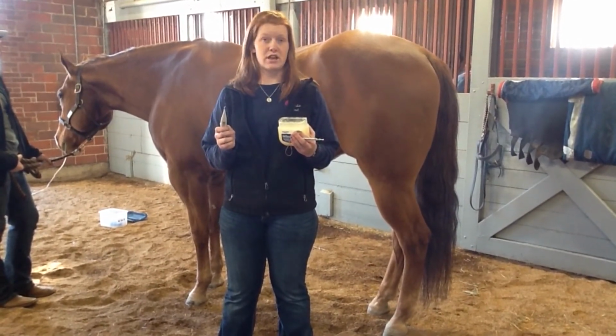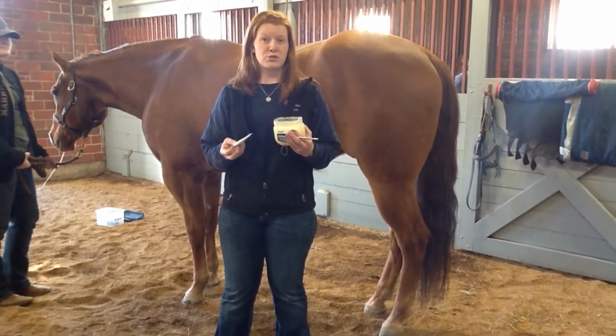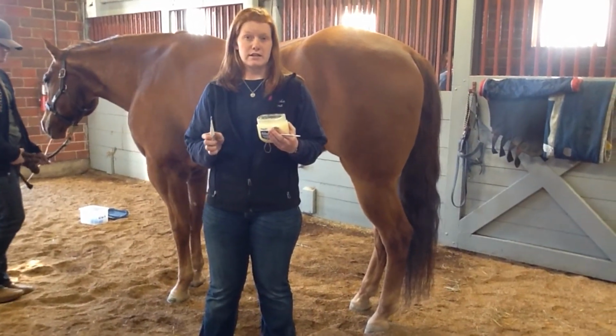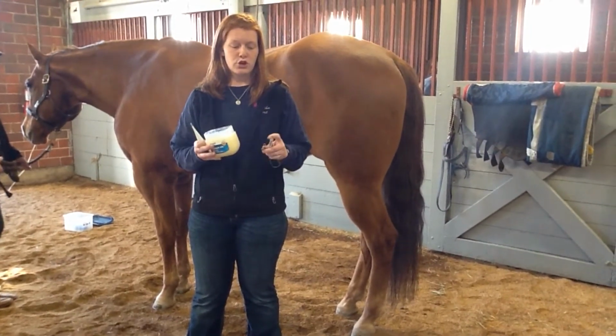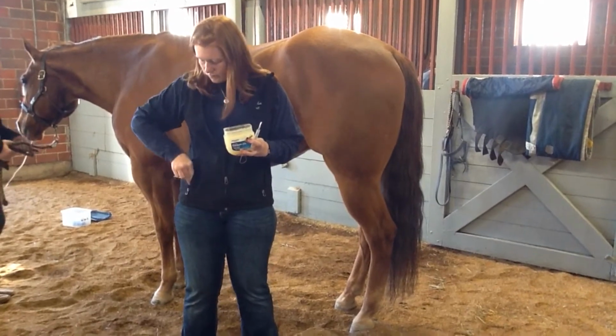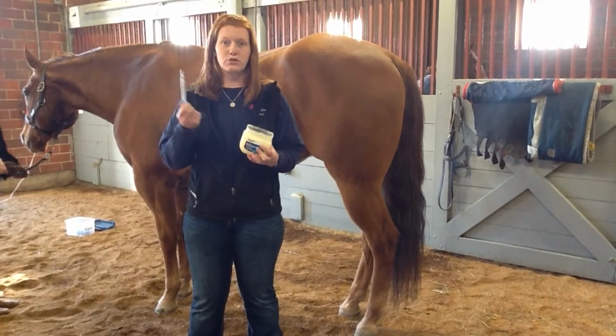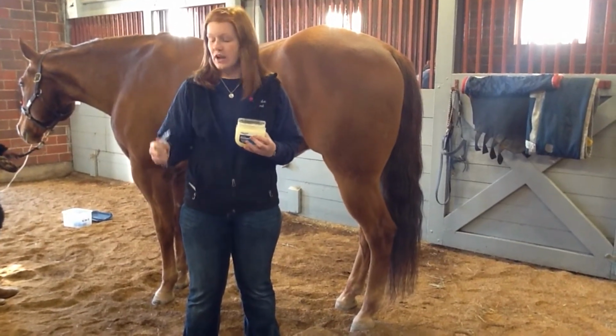If it's up closer to the 101 side of things, you might want to consider taking it with a mercury thermometer just to ensure that they're not actually running a temperature. With your mercury thermometer, sometimes they do run a little warm, and you're going to have to shake them down below the normal range. This one's already shook down, but I'm going to demonstrate how you would shake it down.